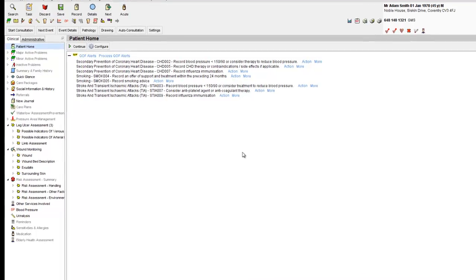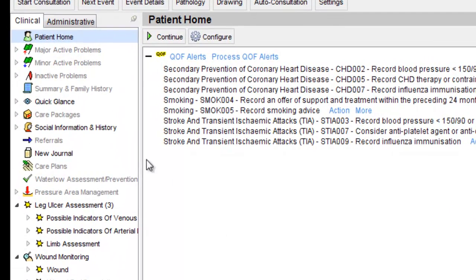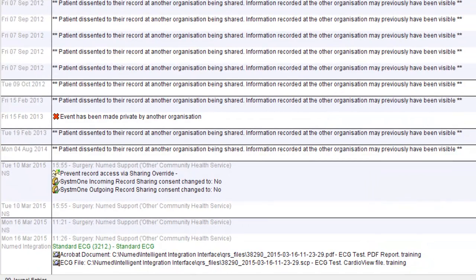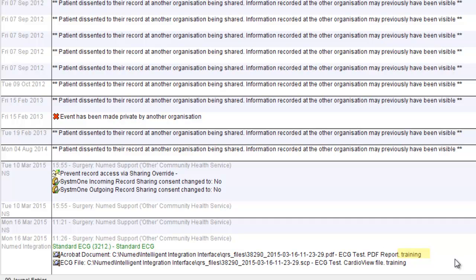The results can now be viewed in the patient record. In the new journal, you will see that the ECG attachment has been read-coded automatically with a 3212 standard ECG read code. Our comment of training can be seen to the right of the attachments.